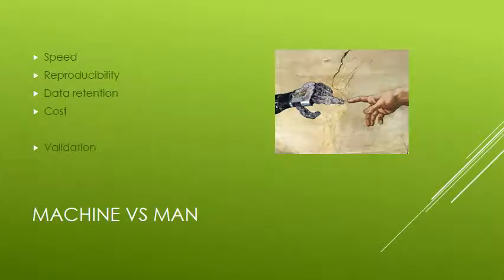So what's the reason for instrumentation, in particular in the microbiology lab? Since a lot of the tests that we've been doing them for manually for so long. Well, there are several things. Obviously, speed is a big thing. We want to be able to get the most accurate results to the physician as quickly as possible to ensure that the patient outcome is positively affected. And obviously, speed would be a feature for that.